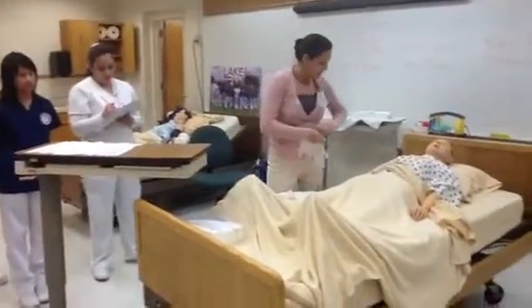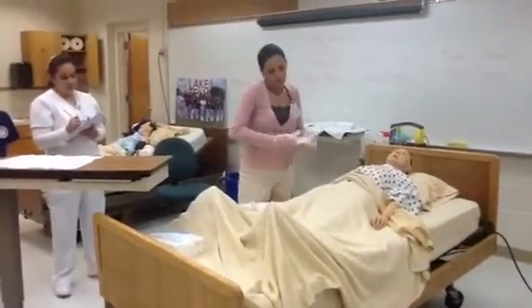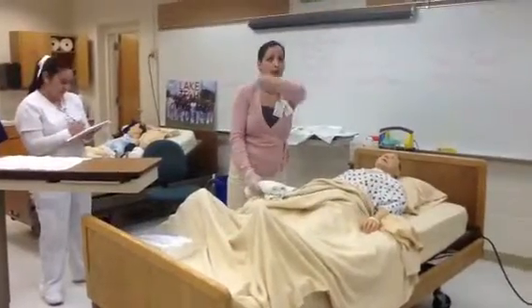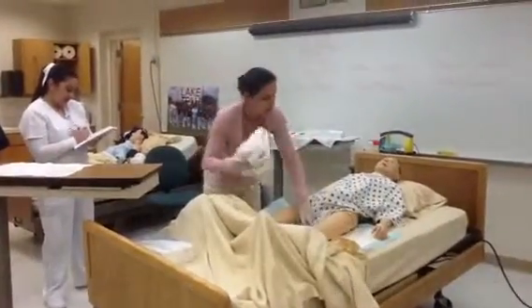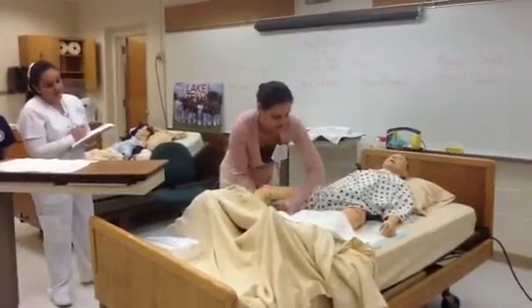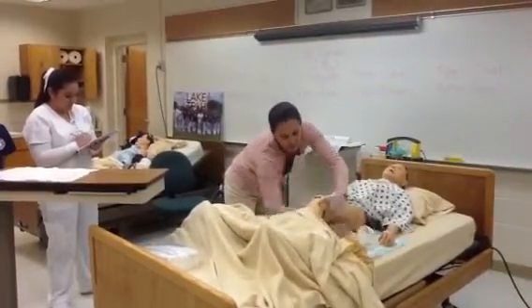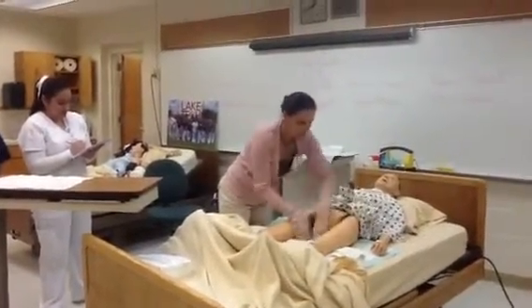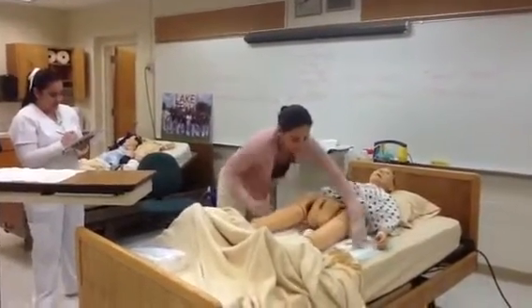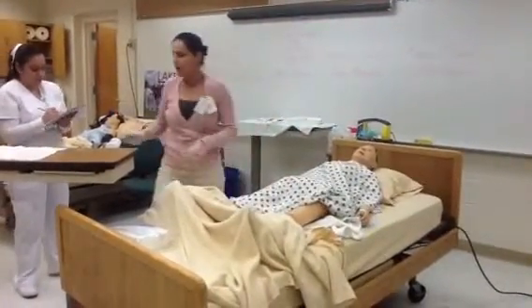Okay, my dear, I'm going to go ahead and slip a pad under your bottom so that we can keep everything nice and dry, and provide privacy before we ever expose our patient. Go ahead and lift up this leg for me. Fabulous. And if you lift this leg up for me, great. Just going to expose you just a little bit here, and go ahead and lift up your bottom. Fabulous. Just try to keep this covered now for a second.